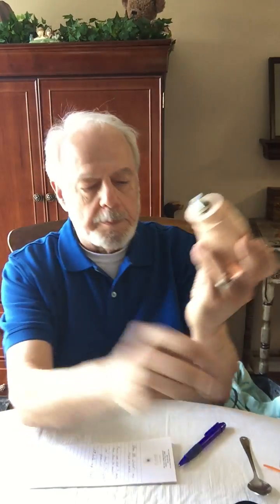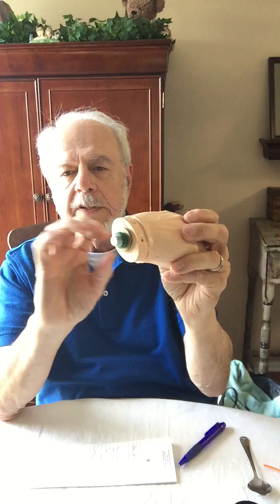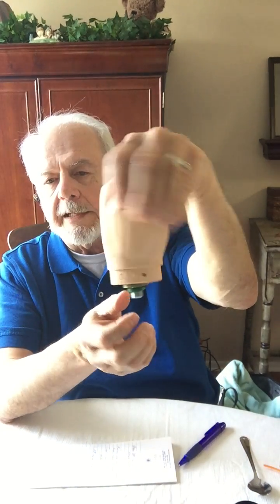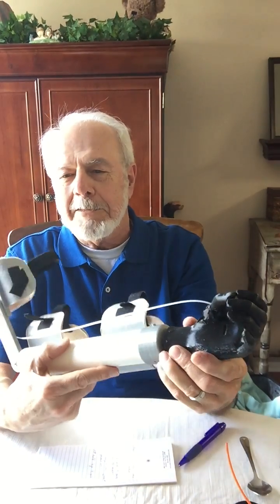And you can see that we are using a standard hex half-inch fine thread screw. And we hold that into the terminal device with a couple of pegs. You can use number six screws, or you can use pegs made from 3 millimeter filament, or anything else you can think of that'll hold that in place. And what we typically do is put on a washer and a rubber ring. And what that does for you is that allows the terminal device to have some friction when you rotate it on the prosthesis. So here's one all rigged up into the device I'm going to show you today.